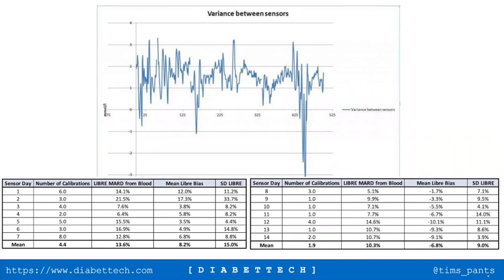The bit I found with it is that it helps avoid alarms going off at night with compression lows because it just takes off those little peaks. And the bit I'm wary of is if I'm doing something that has rapid changes of glucose levels, it just delays the system reaction. Yeah, right.